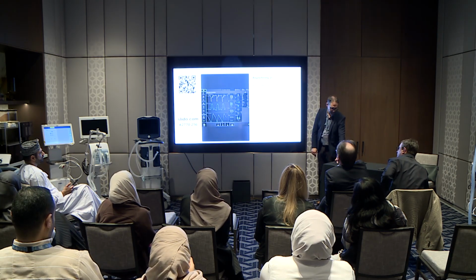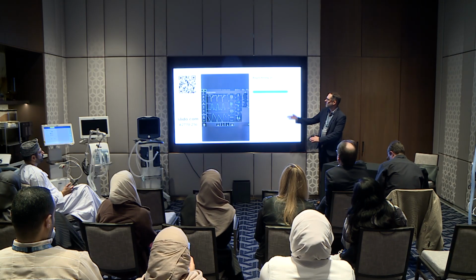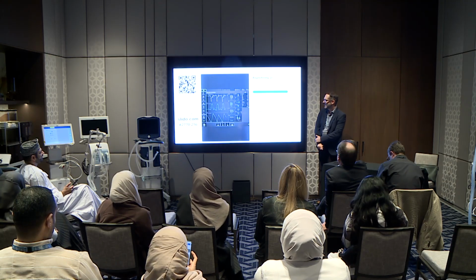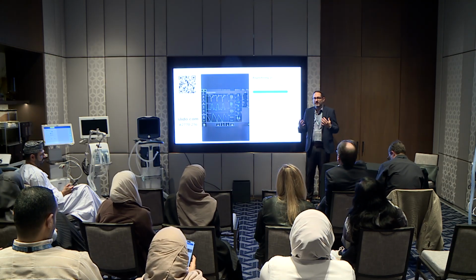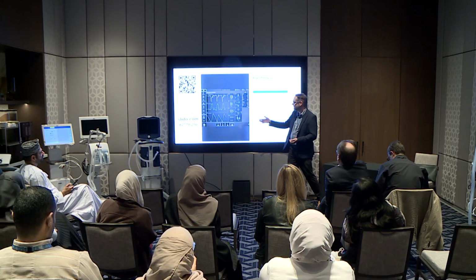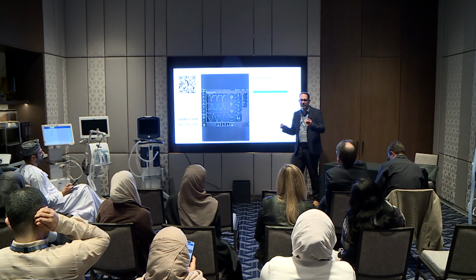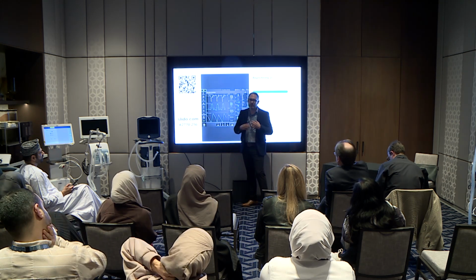Okay. Here. Thank you very good. Thank you very much. Okay. 89%. Now again, technically, patient is demanding more volume. So whether you increase flow or increase volume, like those could be things you could try, but when it looks this severe, I wouldn't even bother.